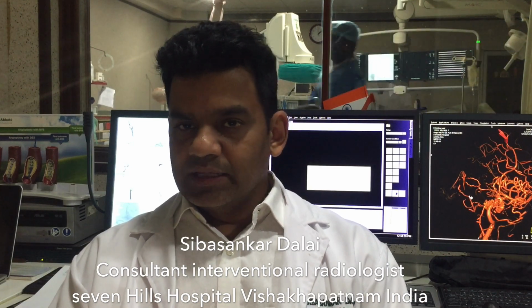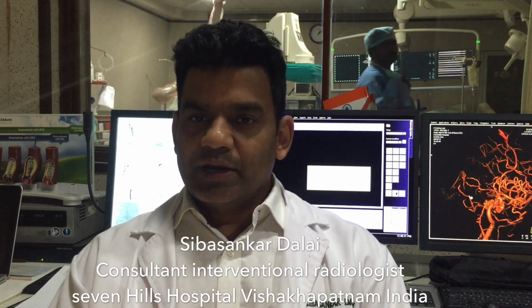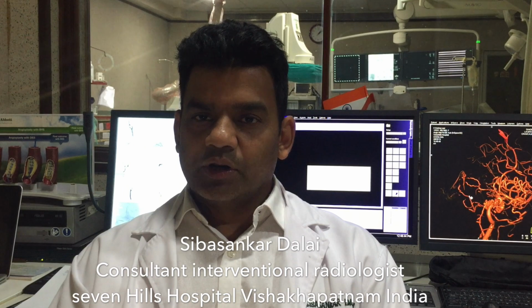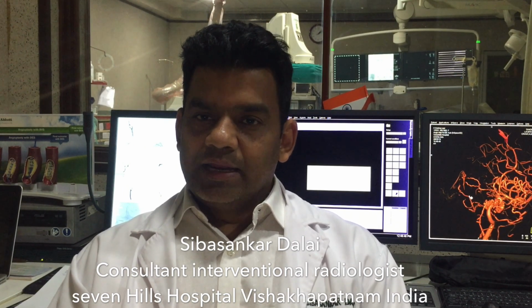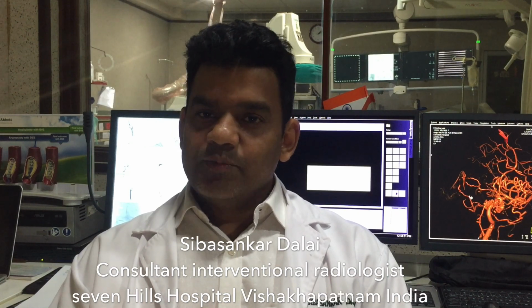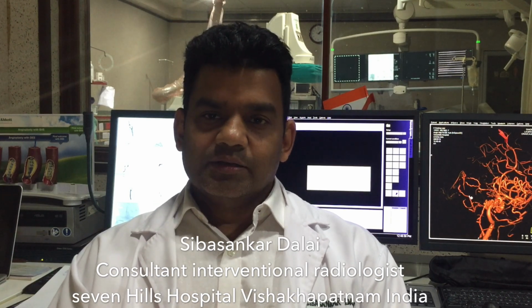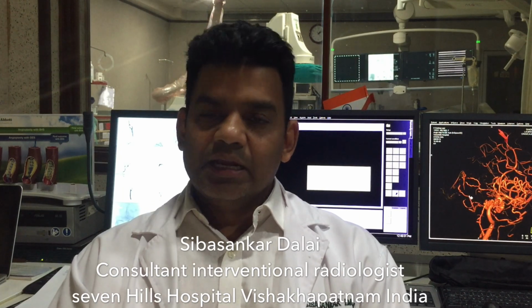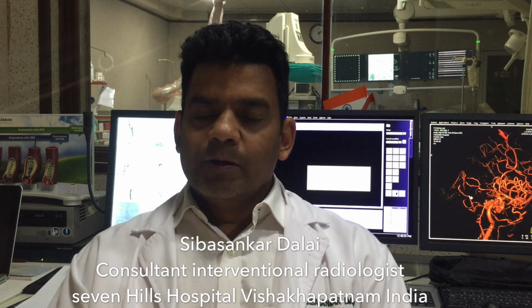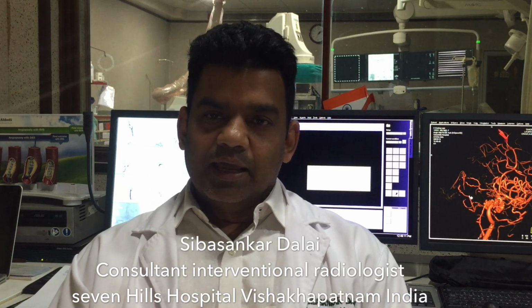Technically speaking, whenever we see this aorto bi-iliac occlusion, sometimes it's very difficult to tell whether it's an acute or chronic disease, and it's very difficult to get from the luminal iliac to the luminal aorta. So most of the time you get a subintimal passage of the wire going up, and you may not get into the true lumen. For that, a lot of devices have come to the market, like the re-entry devices, but it's often challenging.